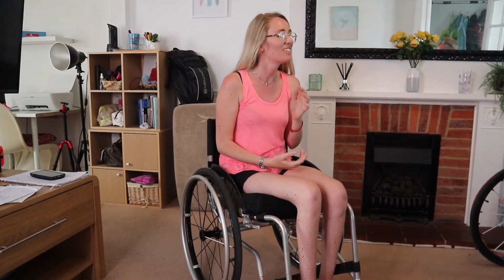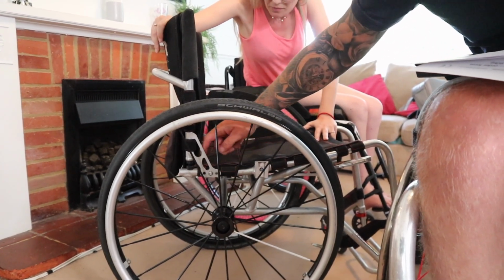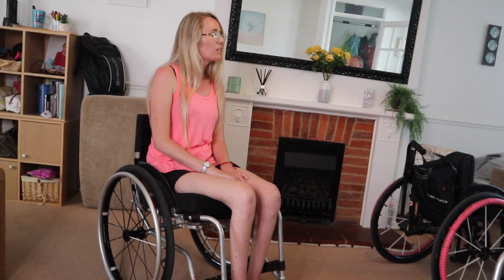what this is going to relate to is how much bucket you're getting in your chair. So obviously if you're going lower on the front, you're going to get less bucket. If you're going to go higher, you're going to get more bucket. Quite happy with how you're sat, or do you want to be higher at the front or lower at the front in terms of that chair that you're in now? I like the bucket in the other one.